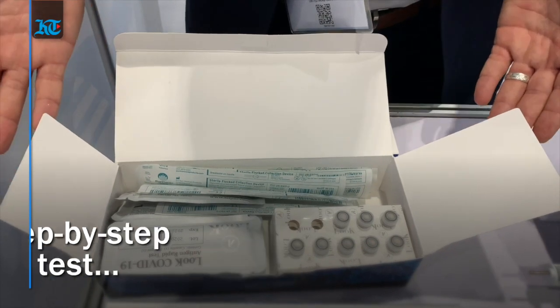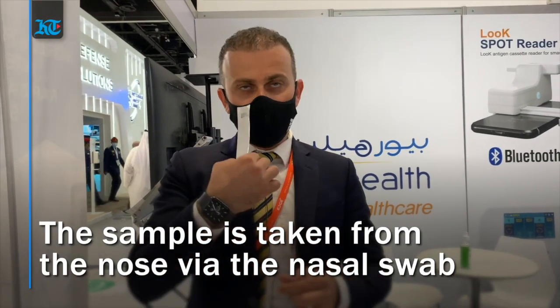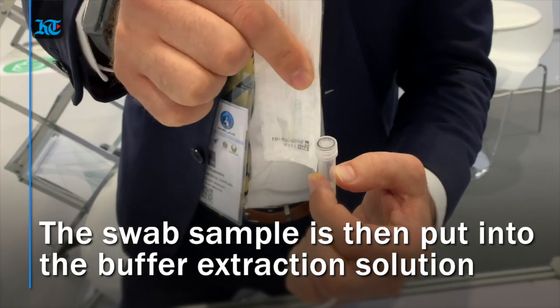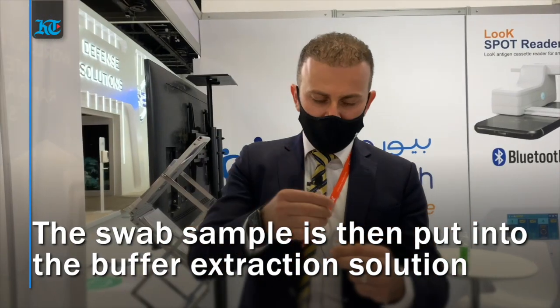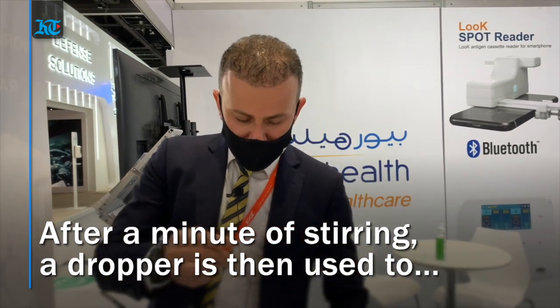Simply, you just take the sample from the nose using the nasal swab, then immediately place the swab into the buffer extraction solution and stir it a little bit.